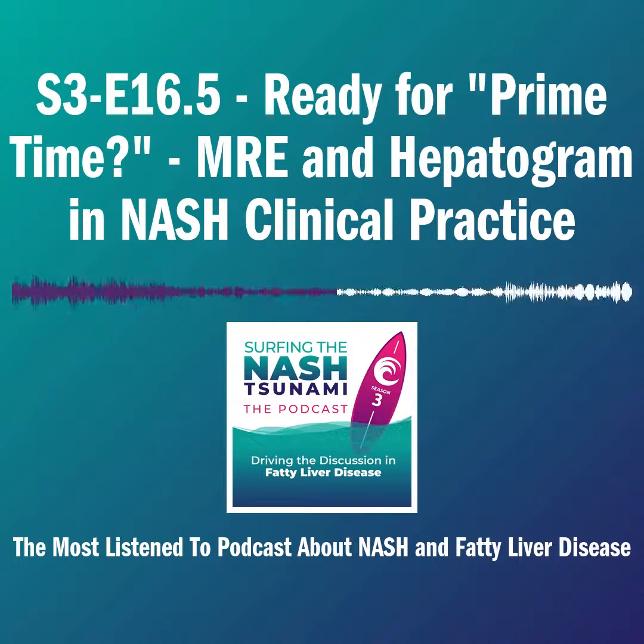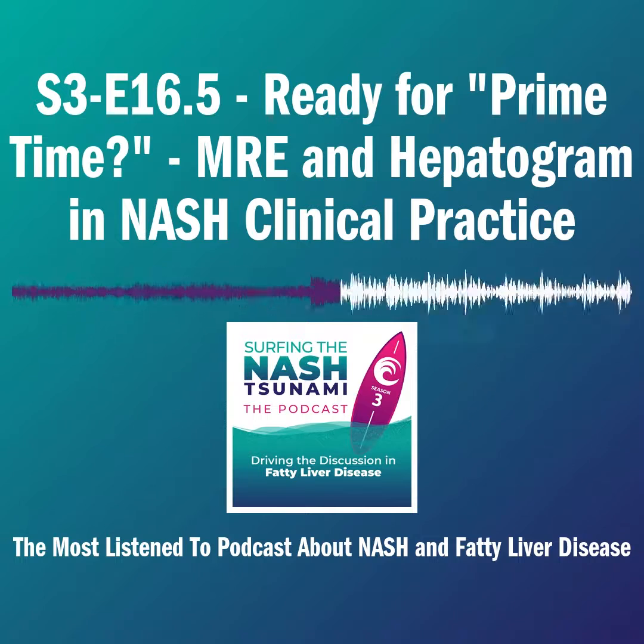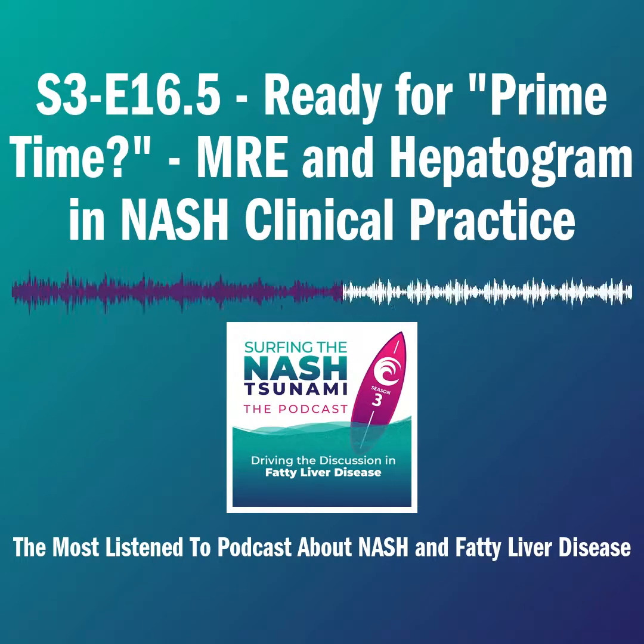Yeah, no, I actually agree completely with Scott. I'd put the question back on you, Stephen, and say, how many studies have we actually seen fibrosis improvement? So MRE is a fibrosis biomarker. We need to see some movement of the needle in fibrosis before we're going to see improvement in MRE. So we just need to combine those studies, use MRE as a biomarker, and have some positive improvement on fibrosis in patients, whether that's weight loss or some pharmacologic intervention. We just haven't had that ideal combination of a treatment that works and MRE used as a biomarker to really acquire that data.